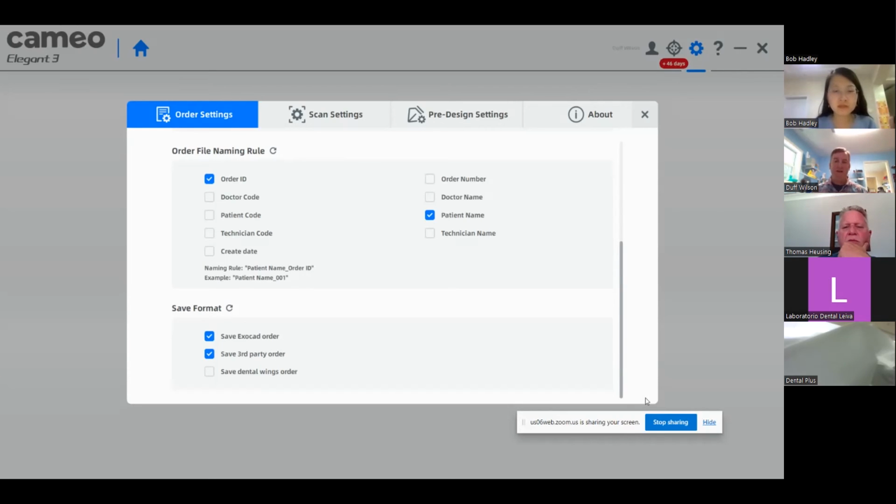My cases, I don't have to pick them up. They come through the portal, so that's UPS not getting paid. There's a lot of money being saved on my back end, and I'm able to say, I'll purchase it, you can use it, and we'll call it like that. That's where locking it in so it only sends to me comes into play.